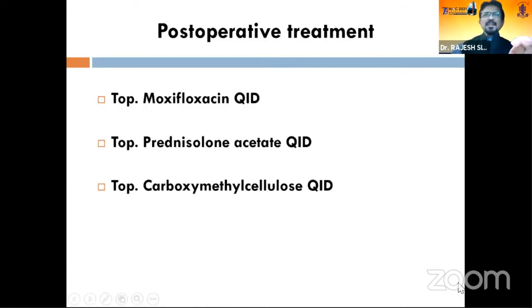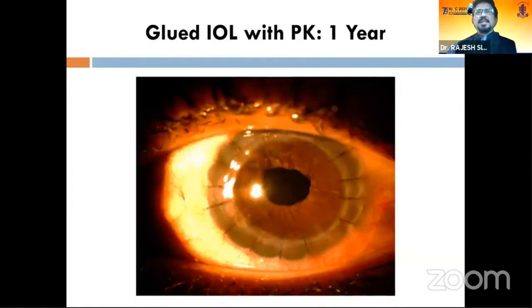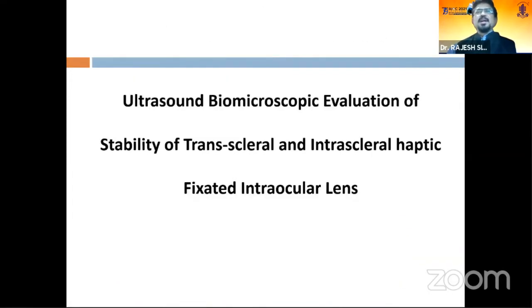So, and this is the post-operative study and post-operative treatment. And this is one study wherein we showed, presented in the Journal of Cataract and Refractive Surgery, wherein glued IOL with DSEK and PK both were performed and both were reported in this particular study. And this is the post-operative picture.